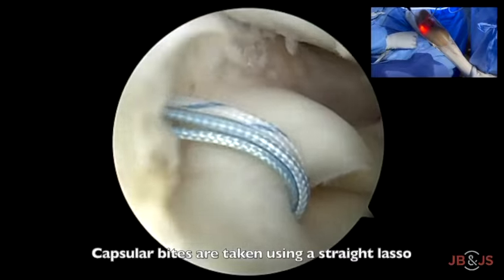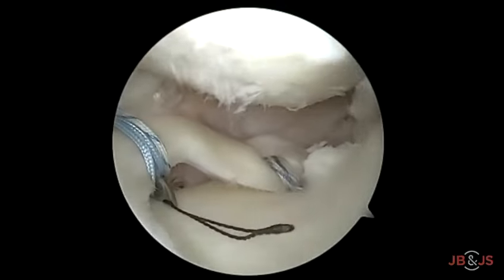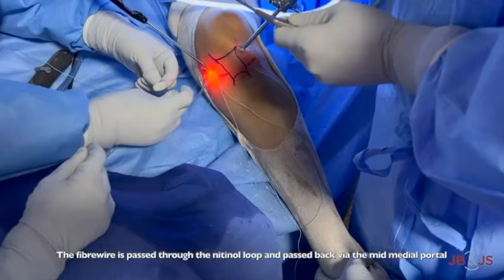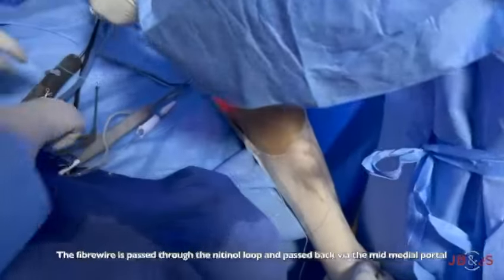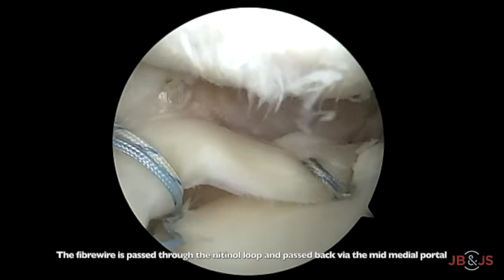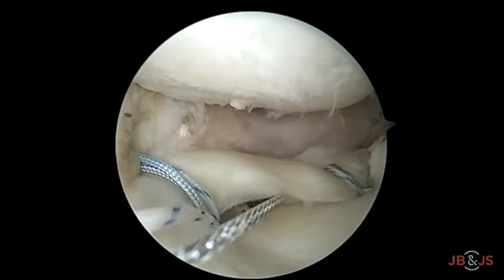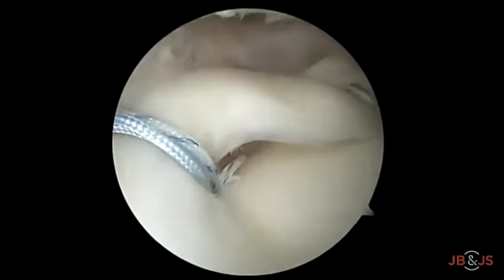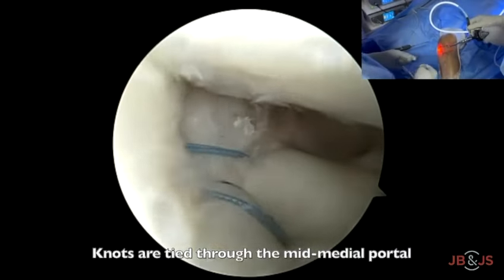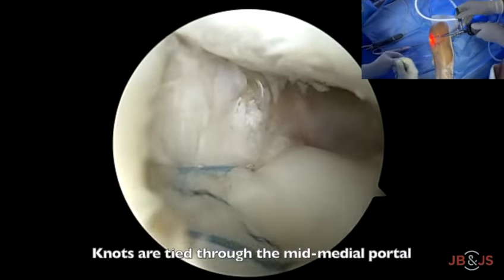A straight lasso is used to take the capsular bite. The nitinol loop and one blue fiber wire are retrieved out of the anteromedial portal. The fiber wire is passed through the loop outside the knee and then shuttled back through the mid-medial portal. The same procedure is repeated with the second white fiber wire. Knots for centralization are tied via the mid-medial portal to secure the meniscus to the tibial rim, with both limbs of the fiber wire shuttled from inside out.